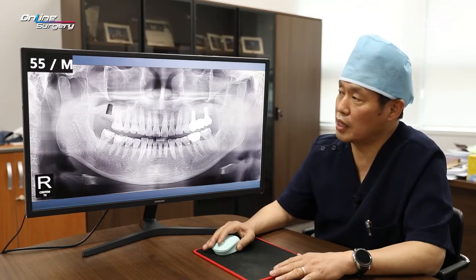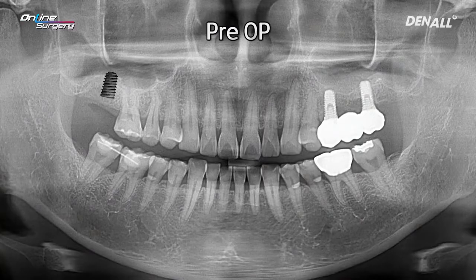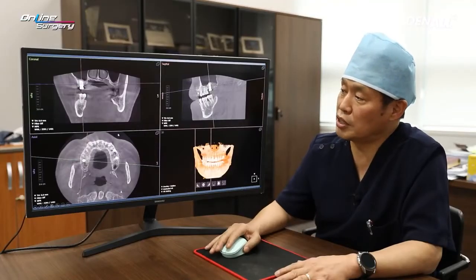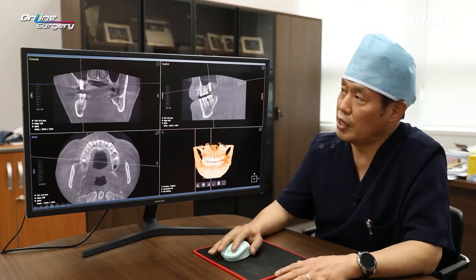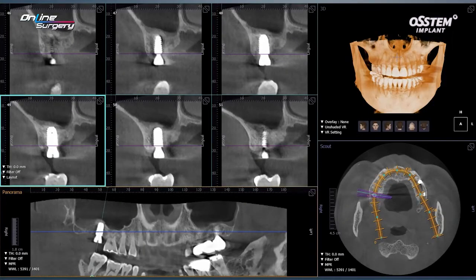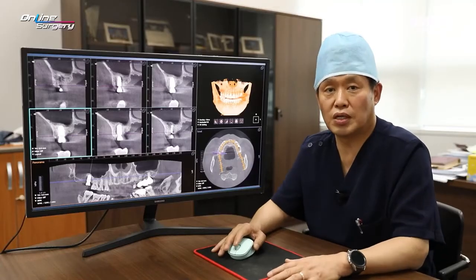On the panoramic image, the intended implant position is shown. In the post-op image, you can see the implant has been placed to the intended position, and bone graft has been grafted at the sinus floor at the same time. On CT, the implant has been placed in the desired position, the sinus membrane is well lifted, and sufficient bone graft has been done. Let's look at the surgical clip.